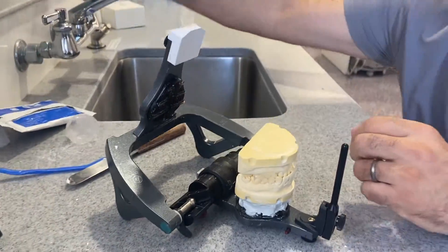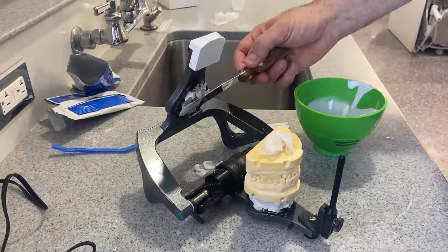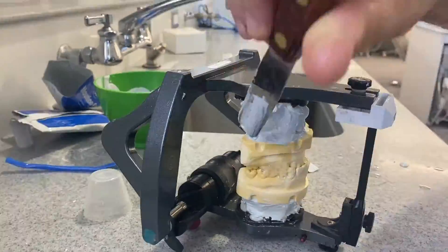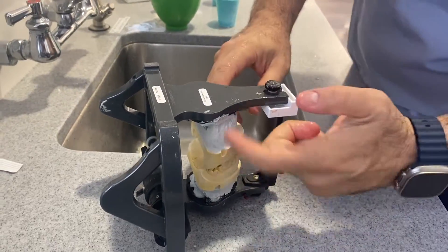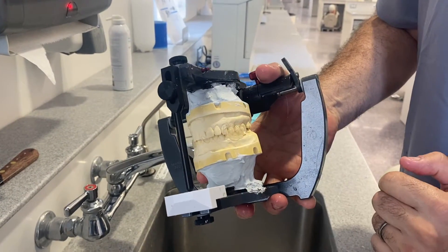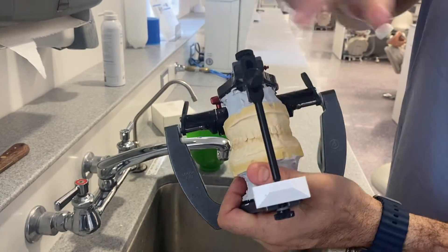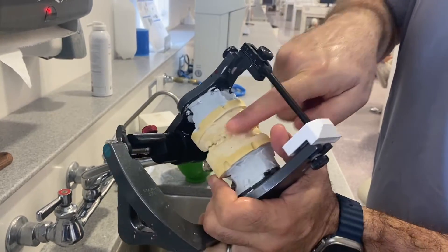I open it up and follow the same process for the lower. Now everything is set. Let's flip it over. As you can see, we have an upper and lower with the mounting stone and the teeth glued together. If I try to open it right now, something's going to give — probably the teeth may break because of that.